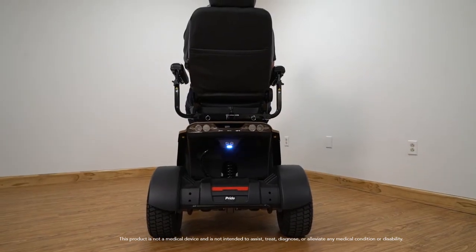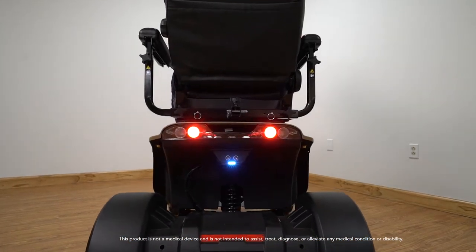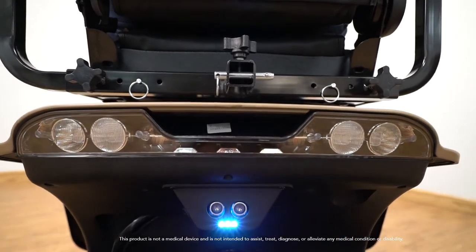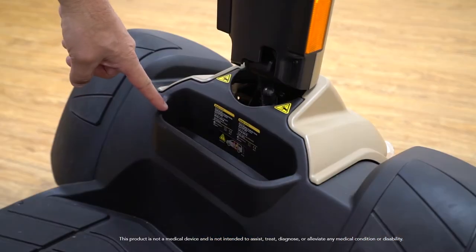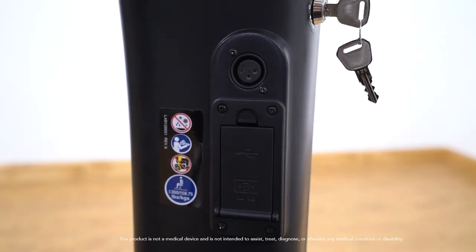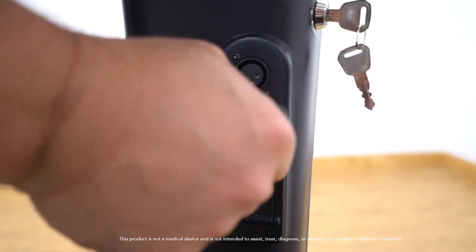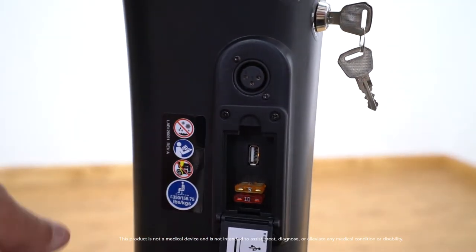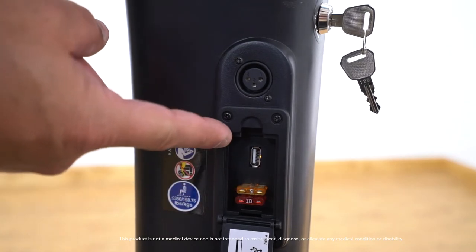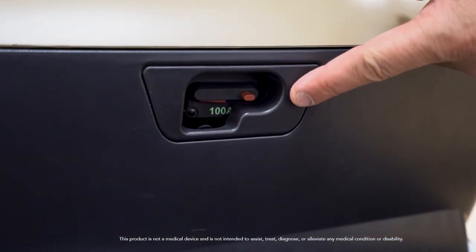The Wrangler also comes equipped with a backup sensor — first in the industry — with reverse lights. The sensor will alert you when you get too close to an object while going in reverse. There is also a storage compartment at the bottom of the tiller. The Wrangler has an onboard charging port located on the tiller. The fuse panel is located underneath the charging port. You will also find a USB charging port for small devices such as tablets and cell phones. On the battery box there is a circuit breaker with reset button.